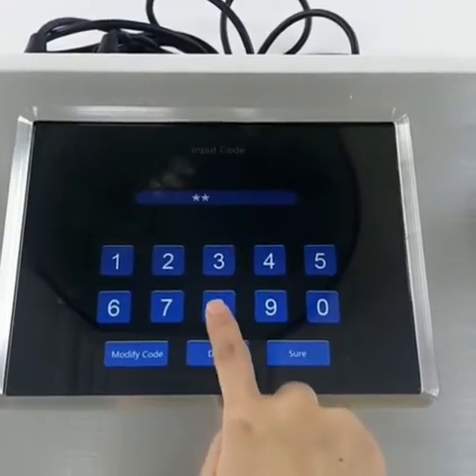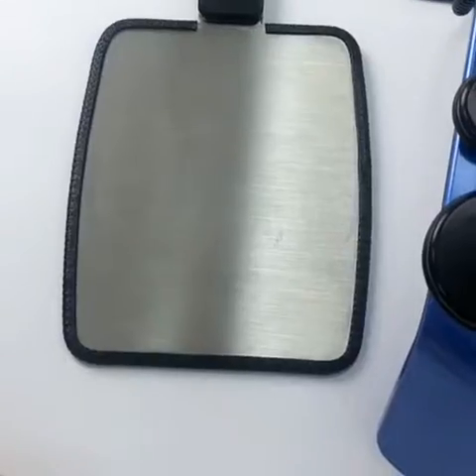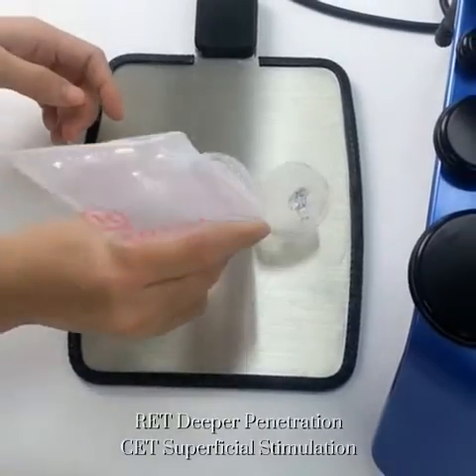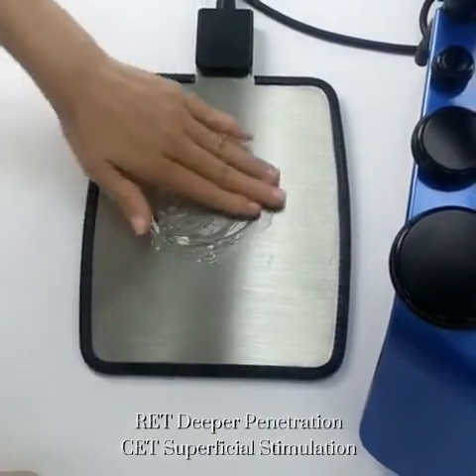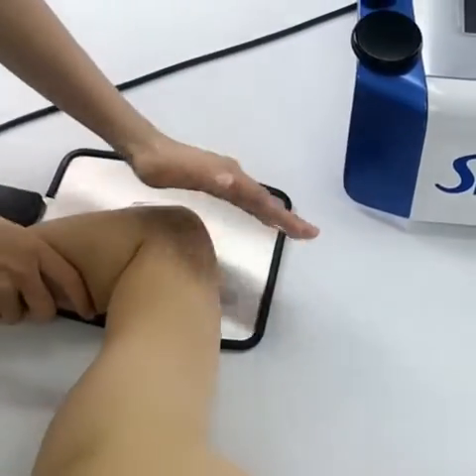Scan through the code and we are going to treat the arm. Apply the gel to the treatment area and electrode plate. It is used to help connect the machine and the treating area.